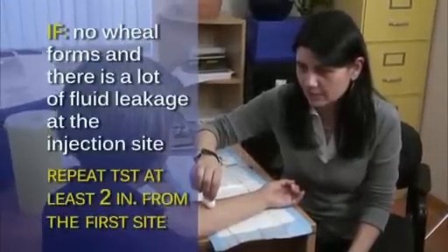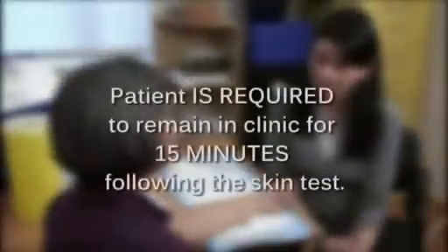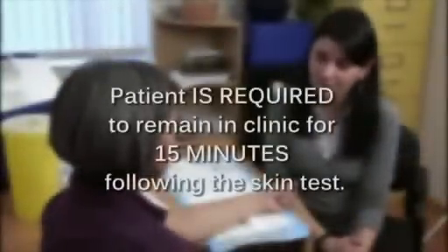Once you finish planting the TST, remind the patient that they need to come back for their scheduled reading. Explain to the patient that the site may have mild itching, swelling or irritation, and these are normal reactions that usually resolve within one week. Inform the patient that they are required to remain in the clinic for 15 minutes following the skin test, to ensure that they have no adverse reactions.